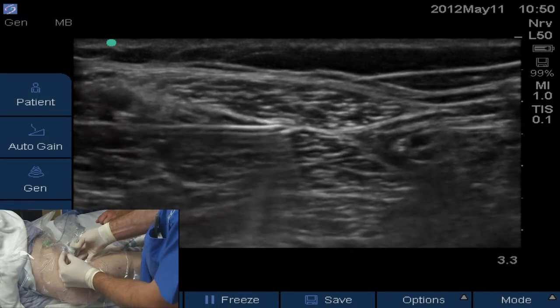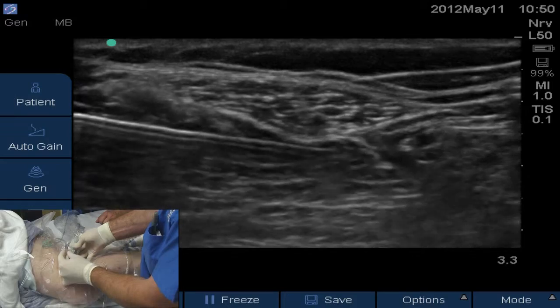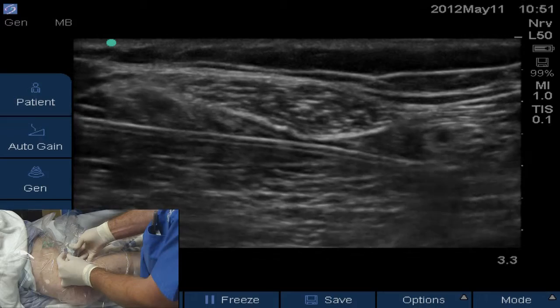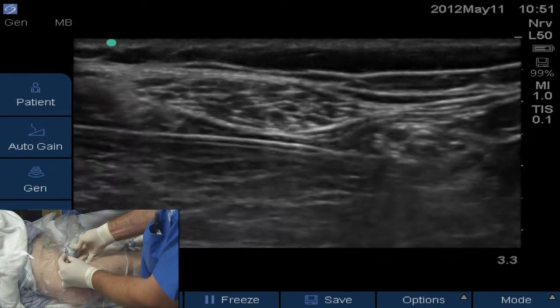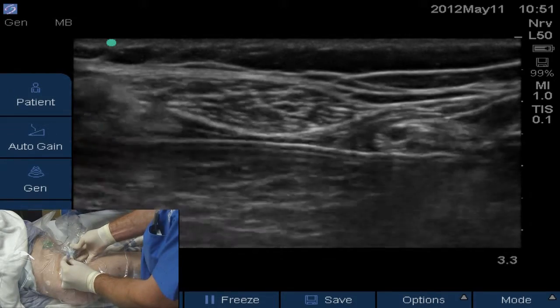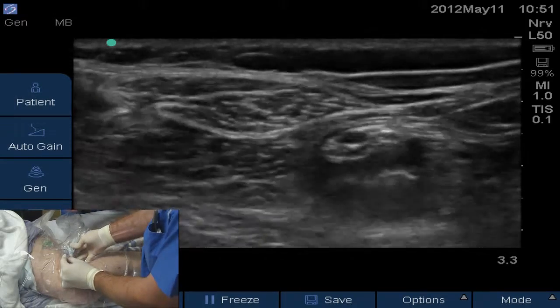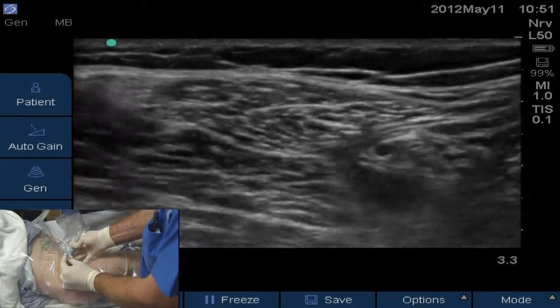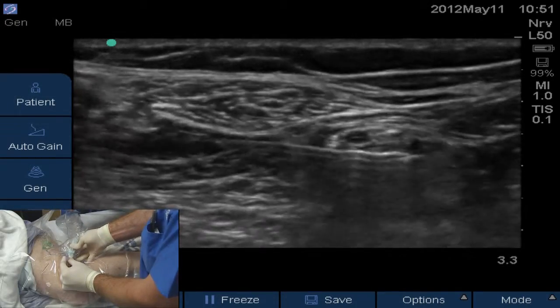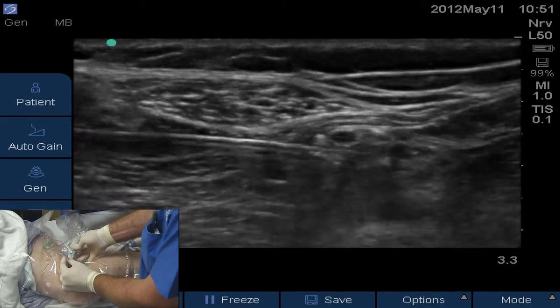You can see the Tuohy needle coming in from the left side of the screen — it's an 18-gauge Tuohy. What we're going to do is allow the Tuohy to come underneath the nerve at about the 6 o'clock position, and we'll start hydrodissecting beneath the nerve with our first 5 or 10 cc's of local. Give 3 cc's of local there, Todd.